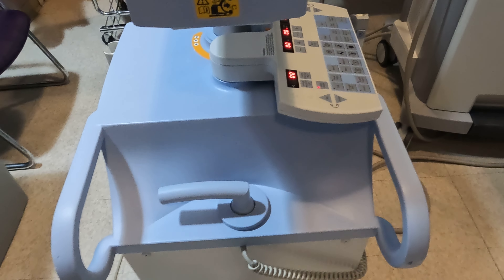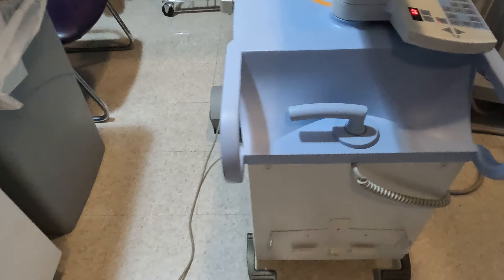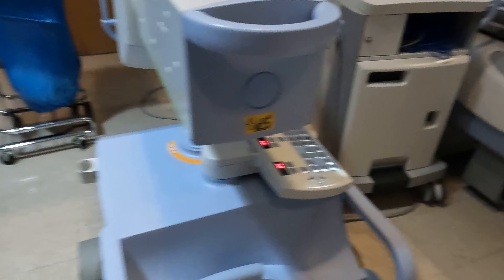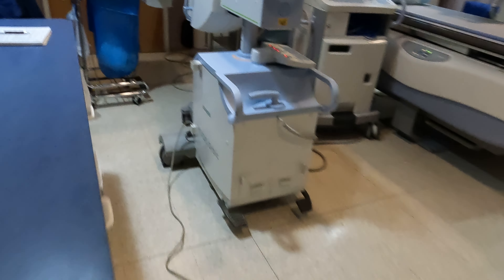Take the foot pedal and bring it as far away from the C-arm as possible. Let everybody know that you're about to start the scan, and ask the anesthesiologist to suspend respirations. Then with the left foot pedal, hold it down and the spin will start.